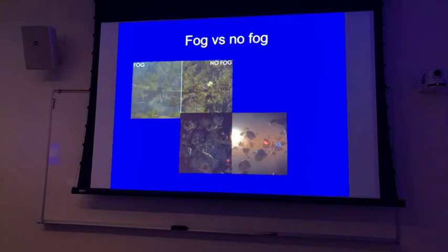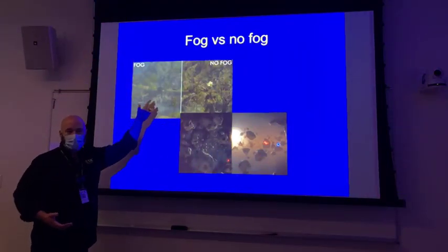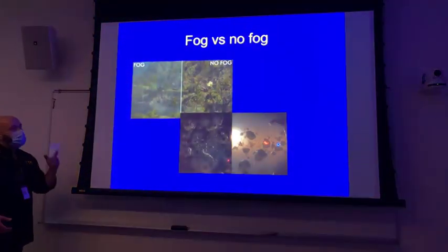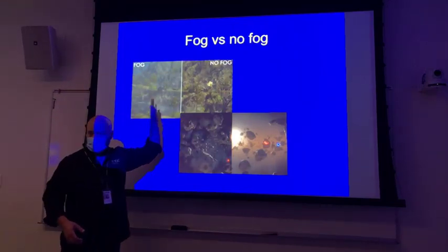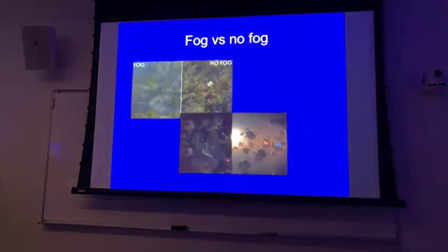Then we looked at those two images, where we have this milky looking, real gray appearance. We've got the presence of fog, and we used the analogy of driving to school and being able to see the landscape real well on a clear day versus a foggy day. On a clear day, we can see those trees real well, and on a foggy day, we can't see them all that well, even though they're still there, right? So sharpness or recorded detail is present on both of those, but the visibility is less on the foggy image. On a foggy day, trees are still there, you just can't see them quite as well.